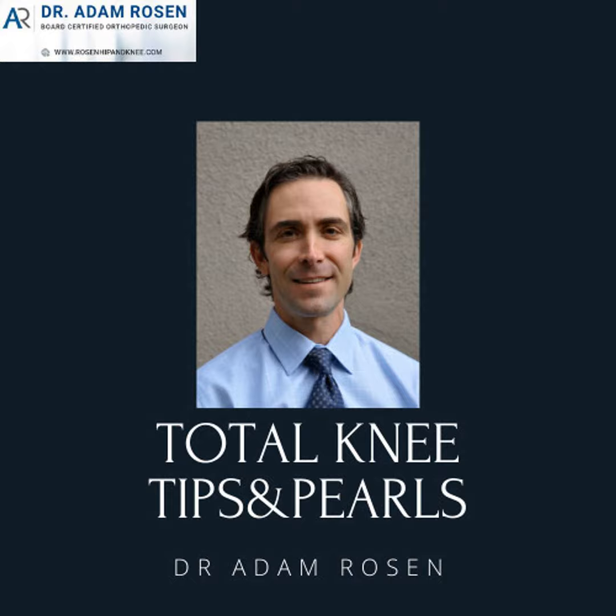So back when sleeves and cones weren't there, your options were an augment or cement. And there's other things. So I'll talk about kind of two things at the end that you could use as sort of an alternative to keep in your bag of tricks and things that you can use down the road. Maybe you get in there and you're not prepared and you have a bigger defect than you thought.